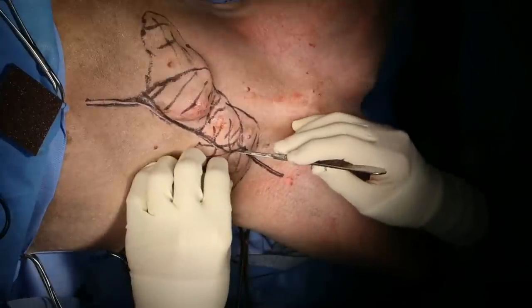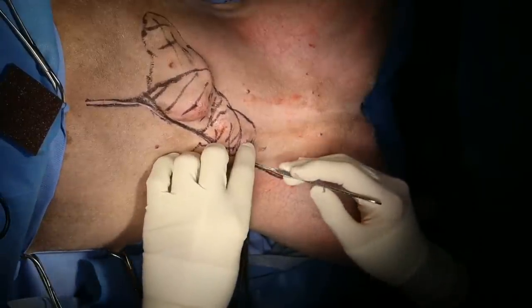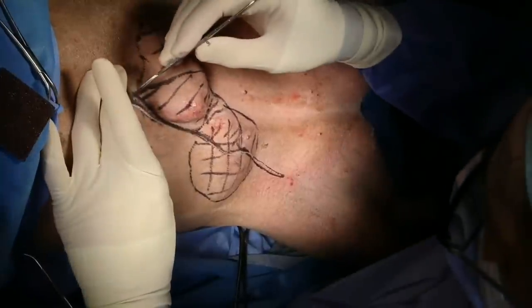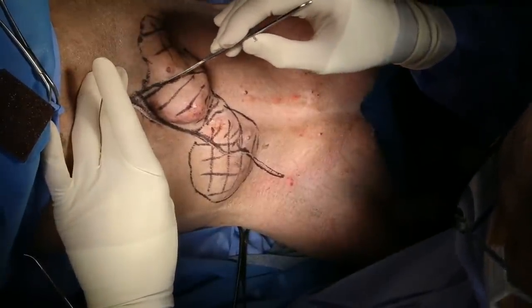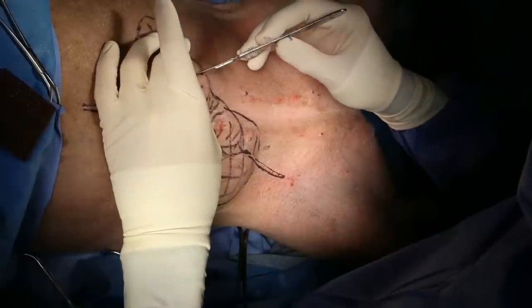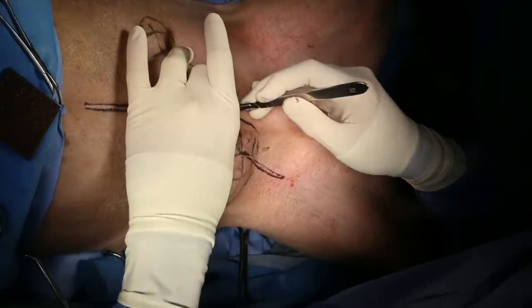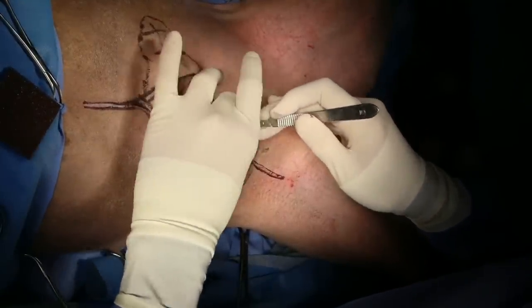I may have to put in a polypropylene mesh to replace the abdominal wall, and we'll decide that as the surgery proceeds. And I'm just being really careful to be superficial with my skin incision so that I don't cut into tumor.